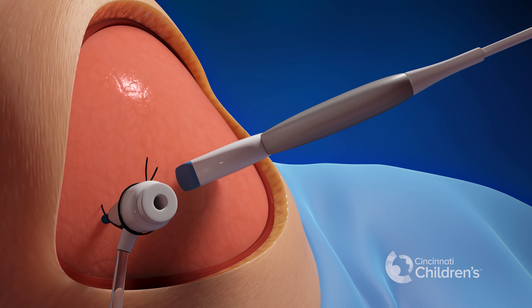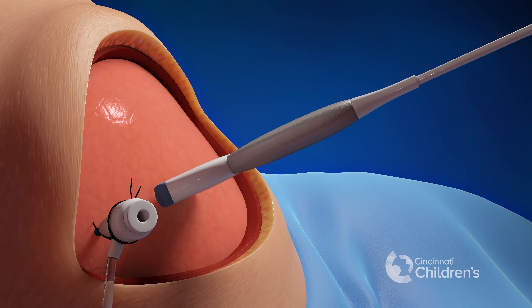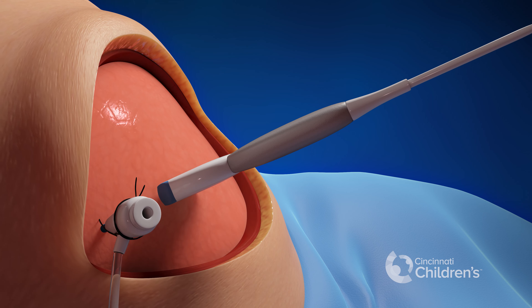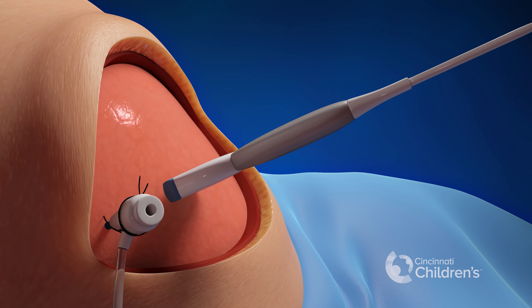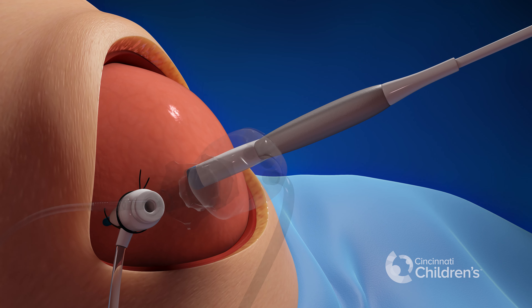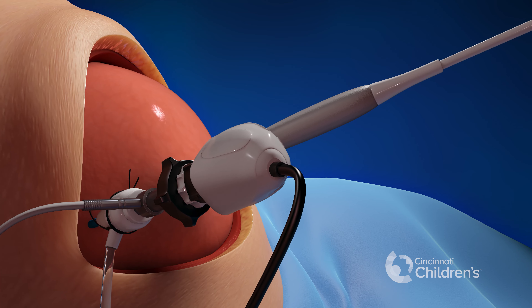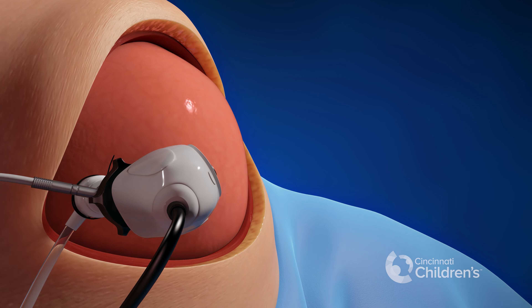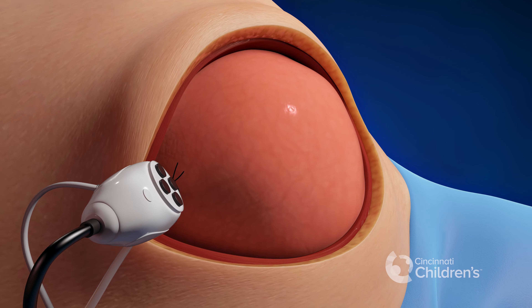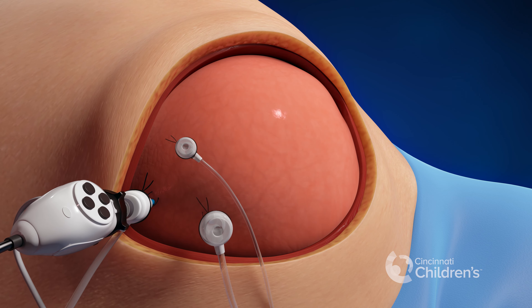We then expand the amniotic cavity using humidified and heated carbon dioxide, which creates more space for us to do the repair. To enable us to see inside the womb, we insert a camera into the amniotic cavity through the first port. Two additional ports are then placed under direct vision to allow placement of instruments for the repair.